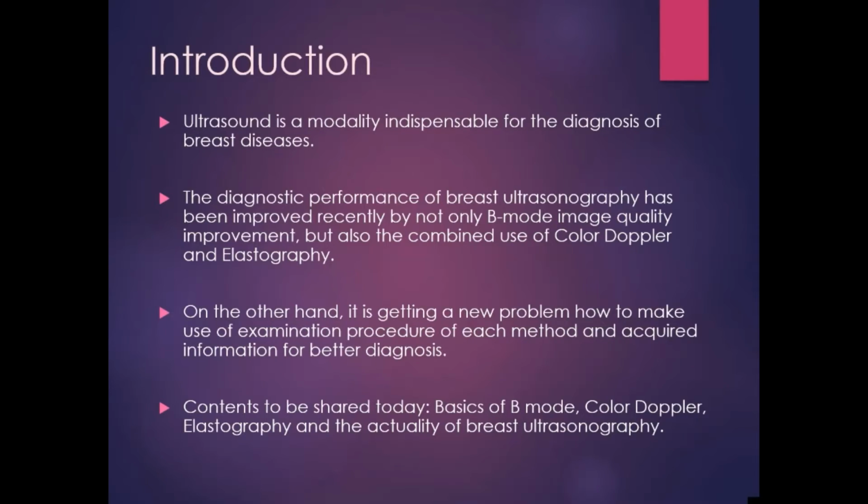On the other hand, it is becoming a new problem how to make use of the examination procedure of each method and the acquired information for better diagnosis. Today, I'd like to explain the basics of B-mode, color Doppler, elastography, and the actuality of breast ultrasonography.